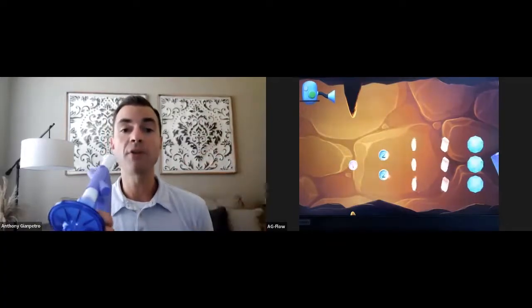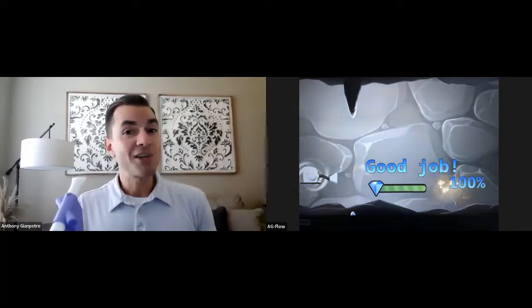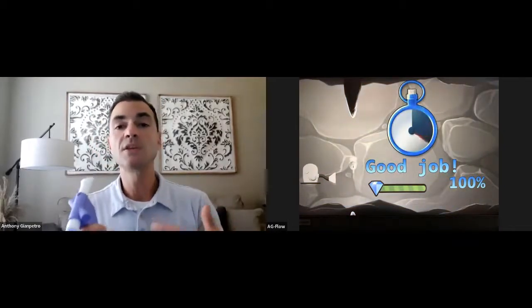So let me go ahead and take a breath in for this. So notice I adjusted the parameters. It wasn't pretty, but it was a good breath for me. So this is what would be appropriate for me to start with. And as I get stronger and better with this device, we can start raising that stalagmite up, making it a more appropriate exercise for progression. Okay. So that's the nuts and bolts of what I wanted to show. But let me give you one more tip.